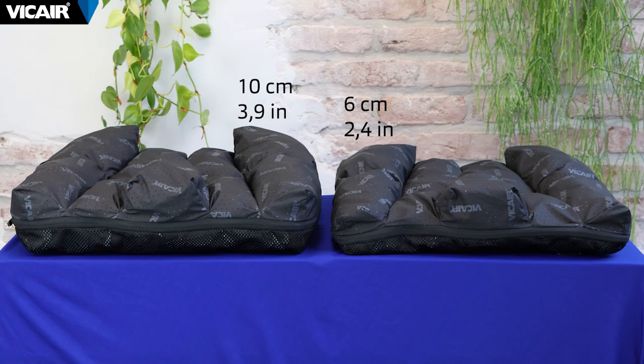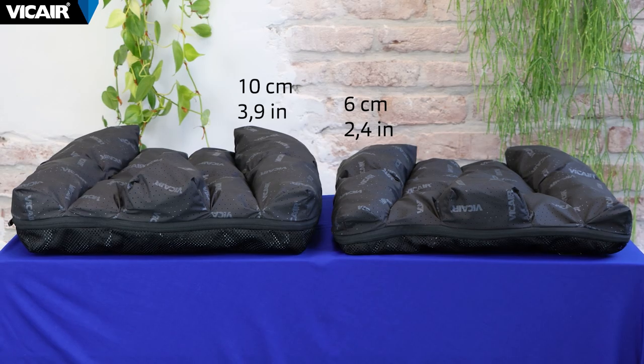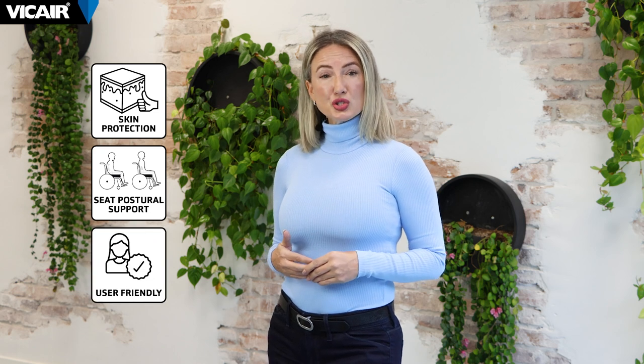The cushion is available in a low model and high model and a wide variety of sizes. The Vector O2 wheelchair cushion offers high performance, skin protection, provides optimal posture support, and is user-friendly. In short, the perfect package.